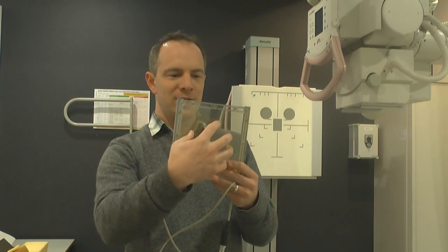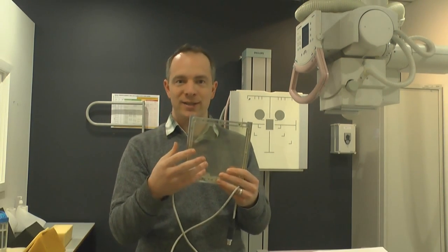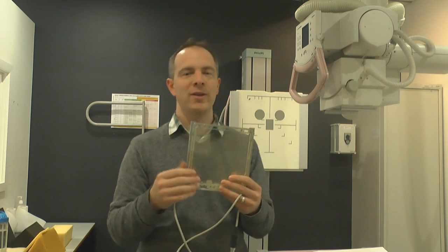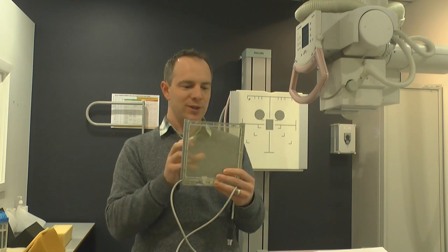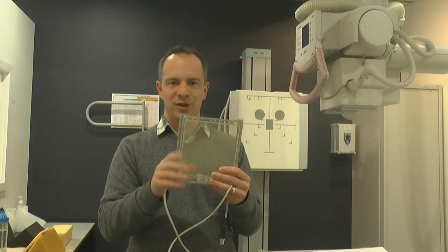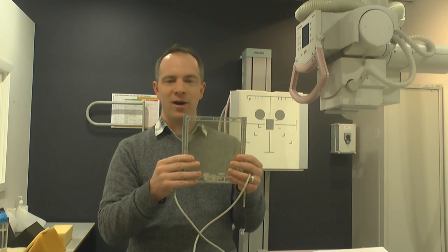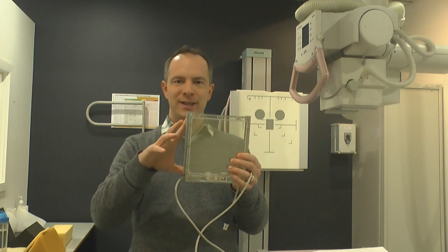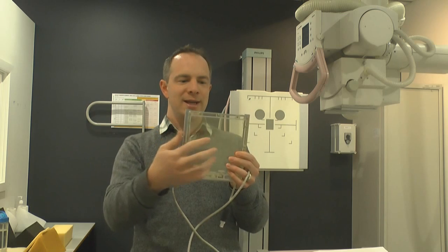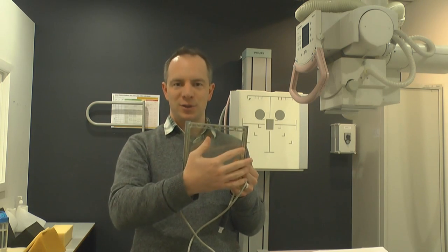So as the X-rays transmit through here, some of the atoms are ionized by Compton scattering or by the photoelectric effect. So in other words, some of the energy of the X-rays is absorbed and that liberates charge. Those charges are now free to move around in our ion chamber. And because these plates have also been charged, any negative charges will be attracted to a positive terminal and positive charges will be attracted to a negative terminal.